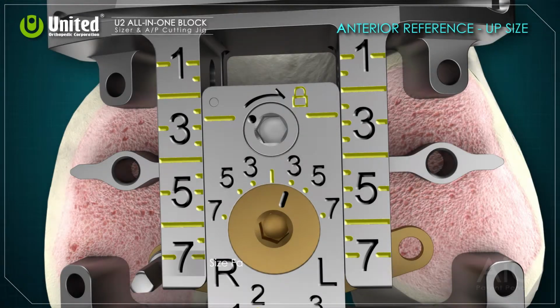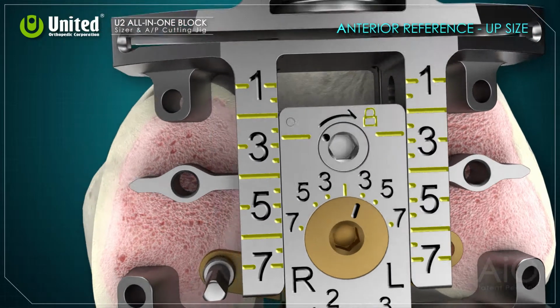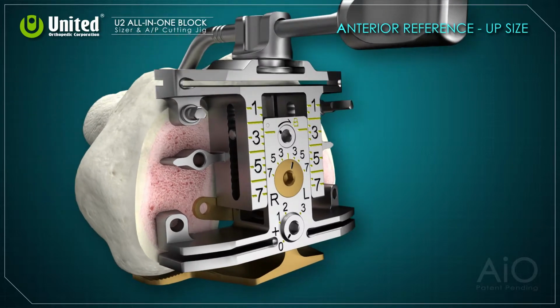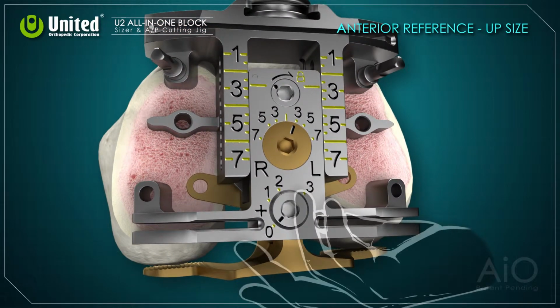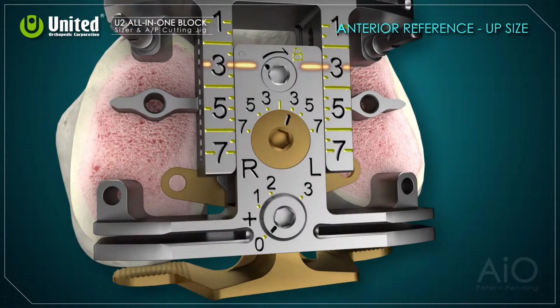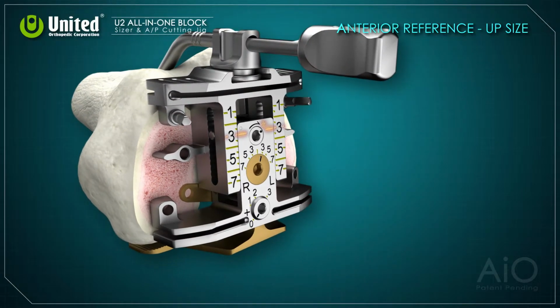In some cases, if the indicator is closer to the larger size, this larger size may be chosen to avoid too much posterior resection. Fix the anterior slot with the threaded pins first. Loosen the fixation pin of the footplate and slide the posterior slot until the size is aligned with the larger one. Then, rotate the upper knob to secure the chosen size. In this case, the posterior cut will be less than 9 millimeters.